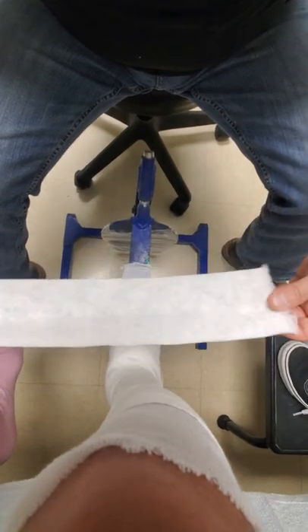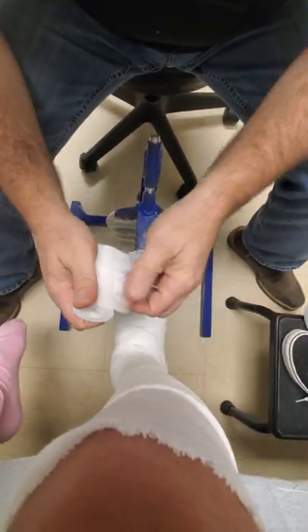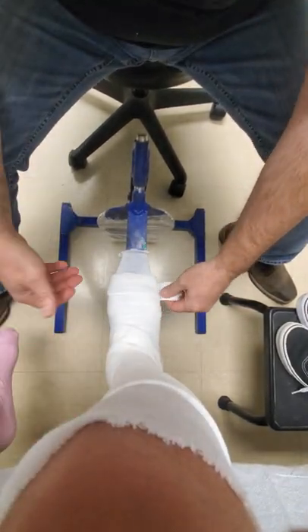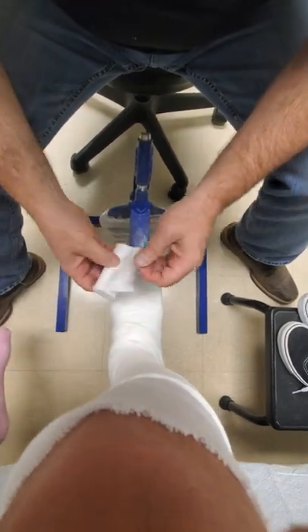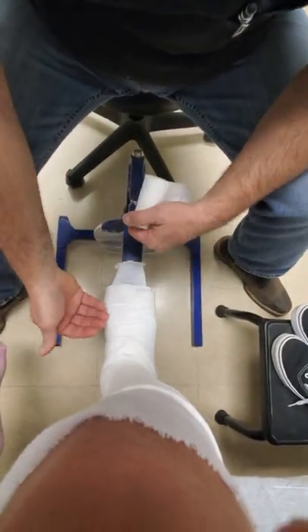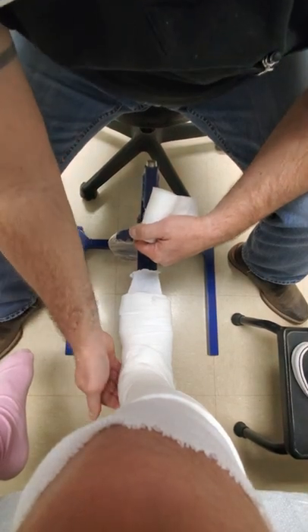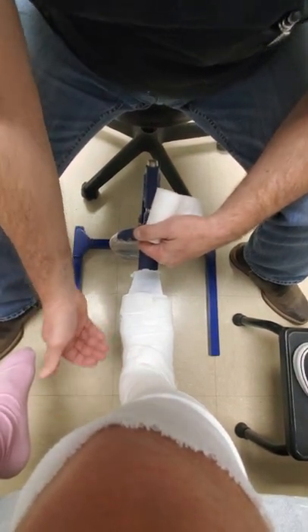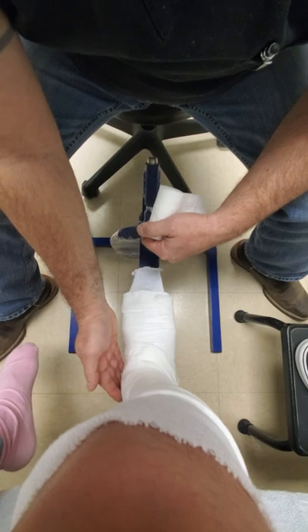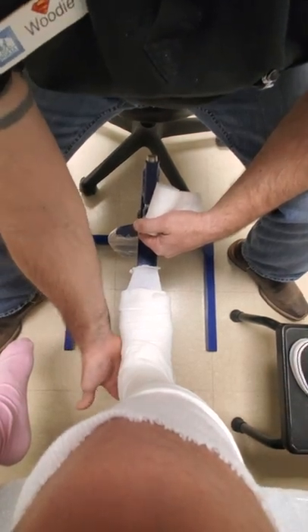Skipping forward a bit so as not to waste time — you've seen me do this numerous times. I take extra strips and create little bumpers on the ends: the toe end and the calf end. I do this with pretty much all my casts because I work with peds. I also reinforce the heel quite a bit. Textbook says two to three layers of padding throughout the whole cast, but on a weight-bearing cast I'll always double that at minimum on the heel, especially with a very active kid. Down at the heel it's going to be at least six to eight layers thick right where the heel makes contact.